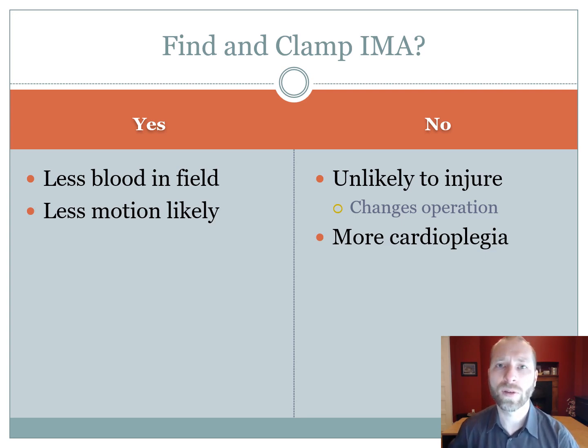If you're doing aortic valve, typically you'll see a lot of blood running out of the coronary arteries. The best solution to this is to go in and cut out your leaflets, and then all the blood that runs down from the coronaries will actually go down into the LVOT, into your vent, rather than hanging out in the area where it's in the way.